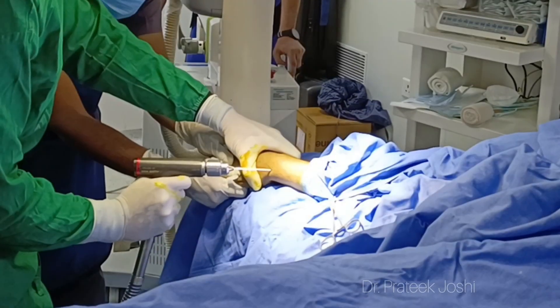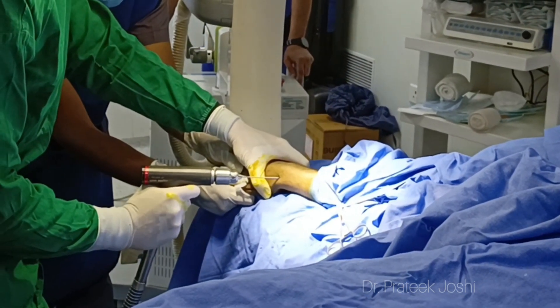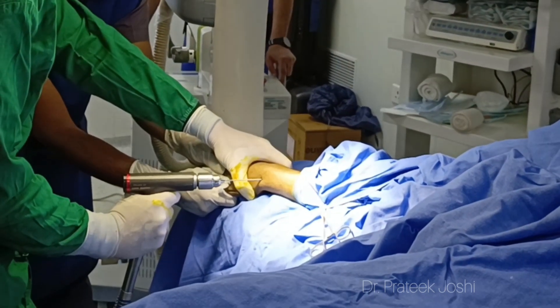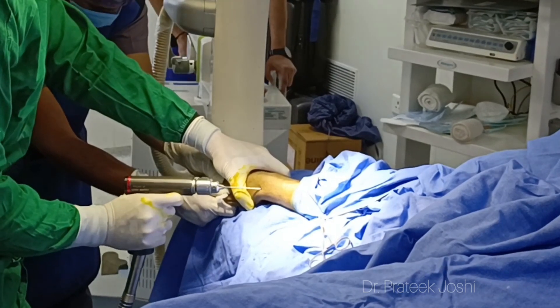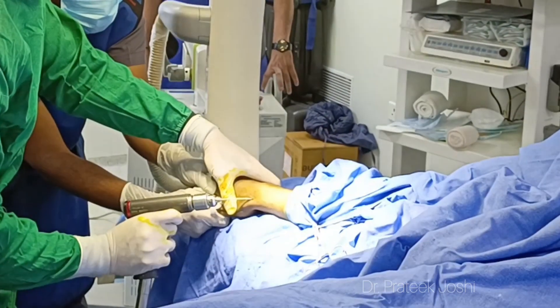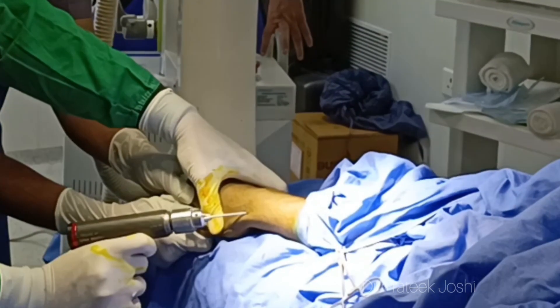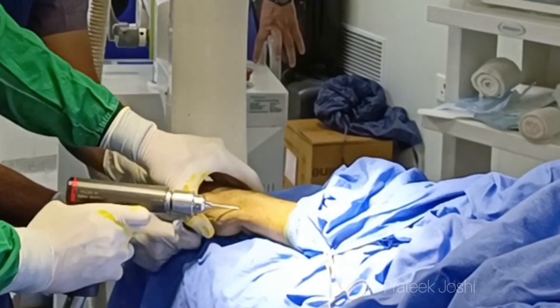My assistant is giving linear traction, and this linear traction is going to disimpact the fracture. On top of that, I am giving ulnar deviation and palmar tilt to the wrist joint, so this is going to reduce our fracture. Under IITV guidance I am going to advance my 1.5 millimeter K-wire.